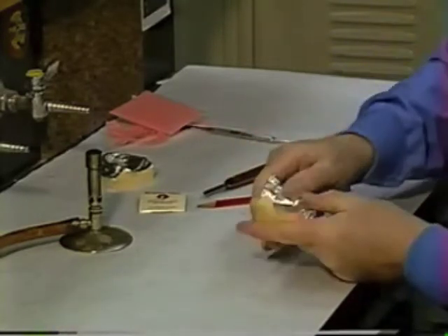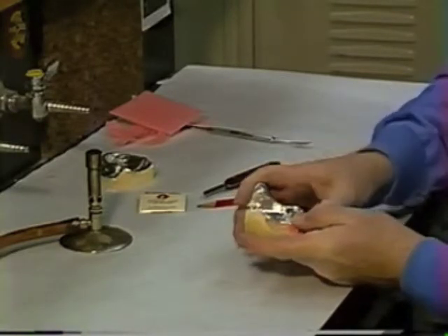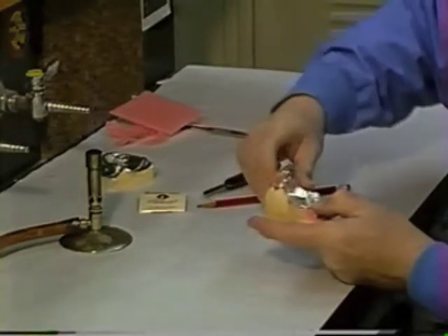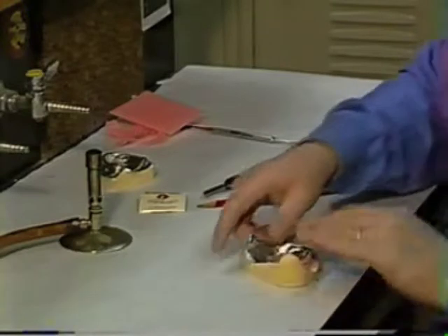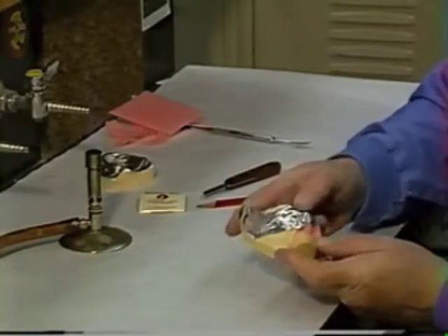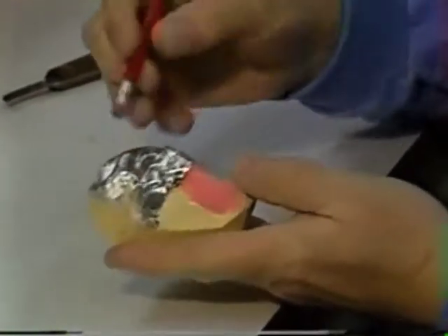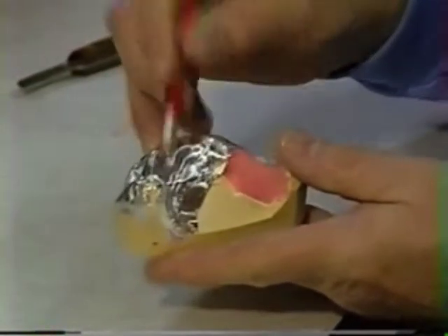And if you smooth it real well, that'll make a very nice separator for your tray material, so that your tray material doesn't stick to the cast, number one, and number two, it doesn't allow the wax to melt and ruin the surface of the tray. So that adapted fairly well just with finger pressure without having to do much else with it. And if you find a few little wrinkles in it, then perhaps a good thing to use for that would be a pencil eraser.